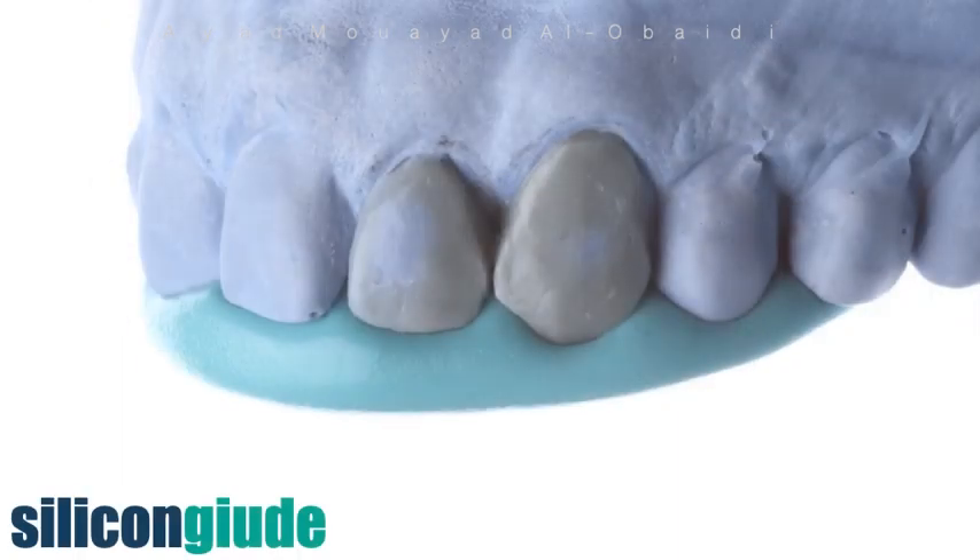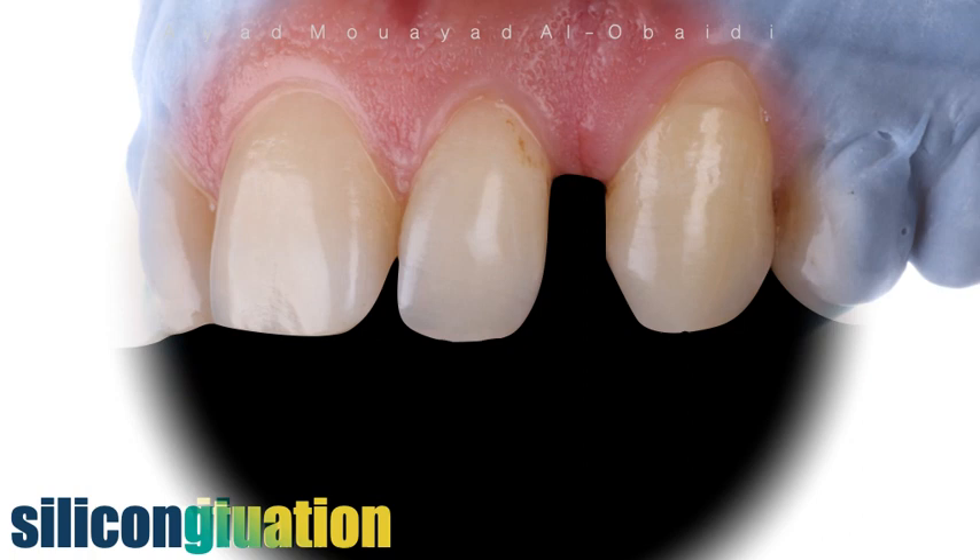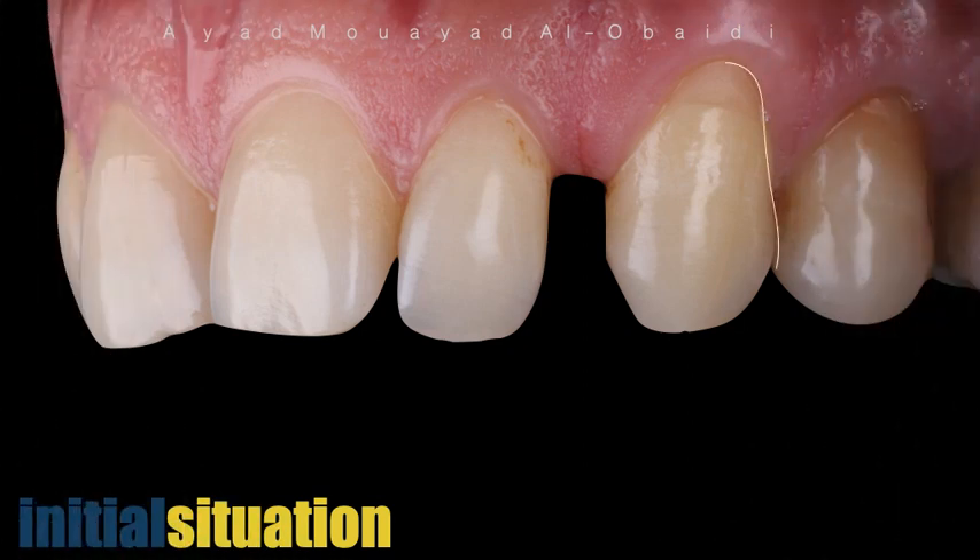The silicon key is carefully pressed and adapted, assuring that the silicon fits perfectly with no pressure at all. Now we are ready to make the planned diastema closure.